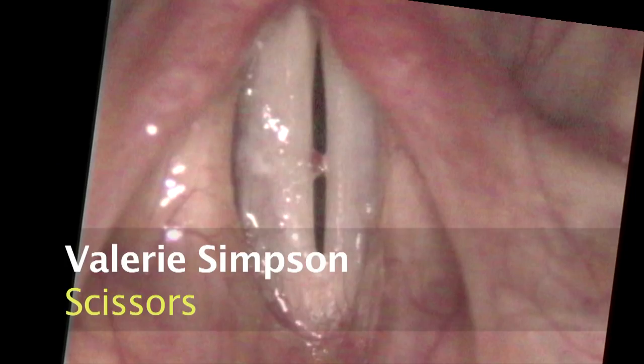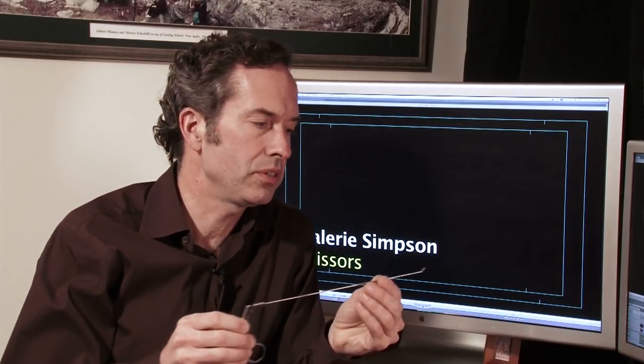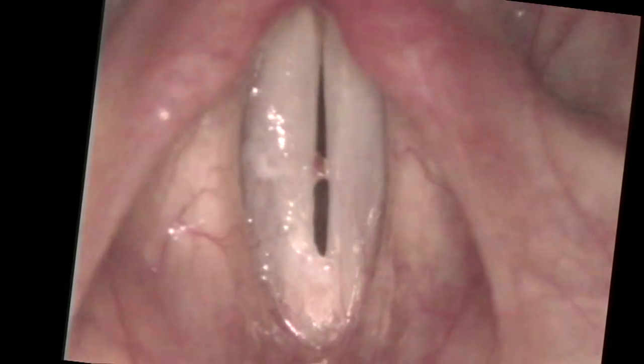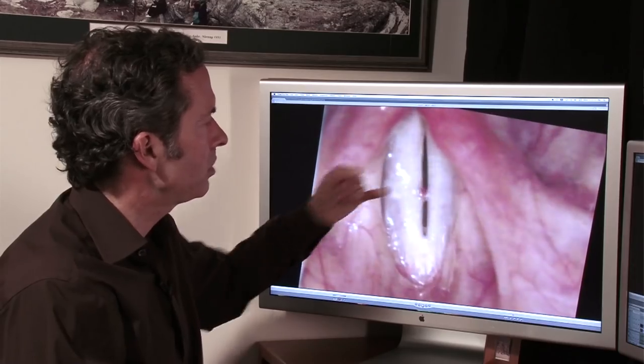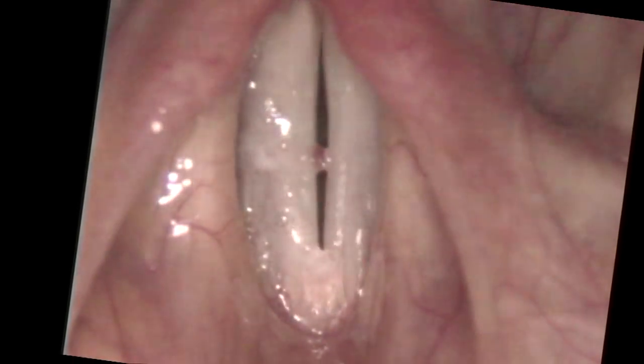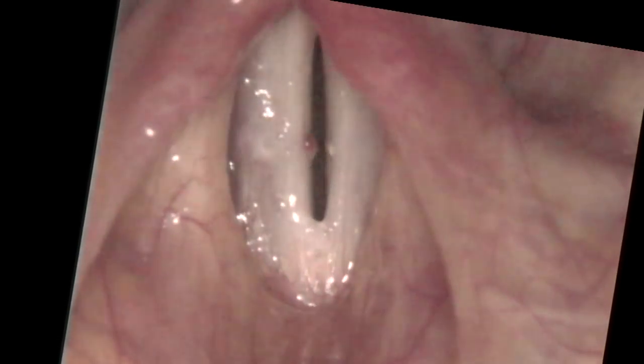What if you don't have a laser? You can use the same type of instrument down the throat — a scissors that opens and closes at the end — and cut off the hemorrhagic polyp. Let's take a look at Valerie's polyps. She has a rather small polyp located in the middle on the right side. She's got the air leak and the diplophonia.